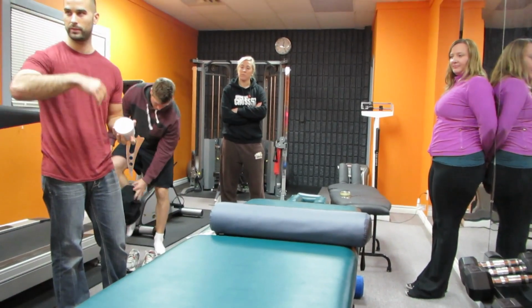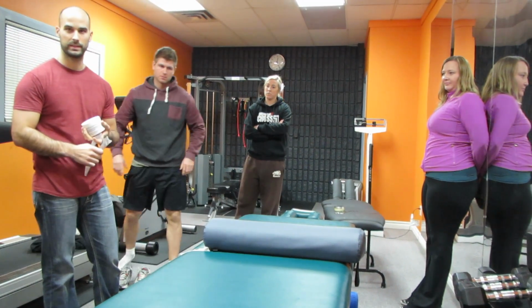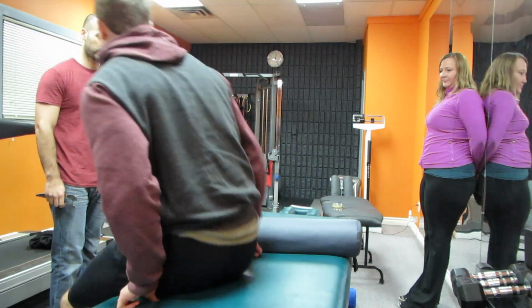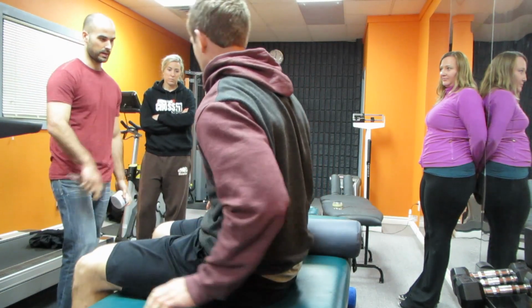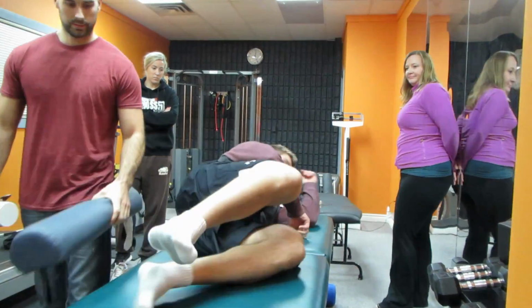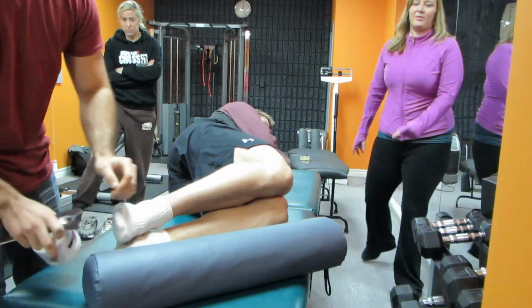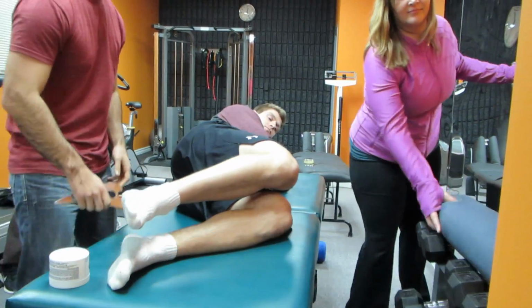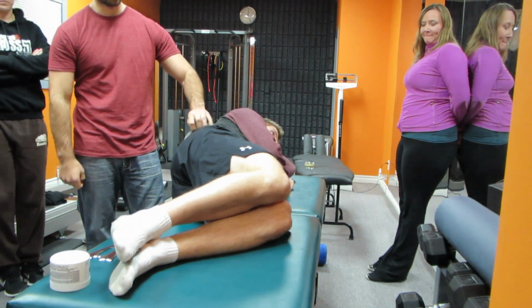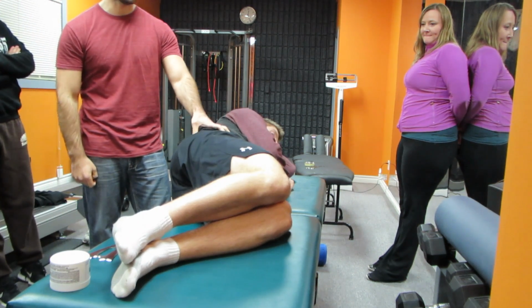Same way that we were treating before, face down, leg out a little bit, the same way we were treating the calf. So what we'll start with is, why don't you face that way and get on your side. So we're going to start off doing a couple of things around his glutes in here, okay?